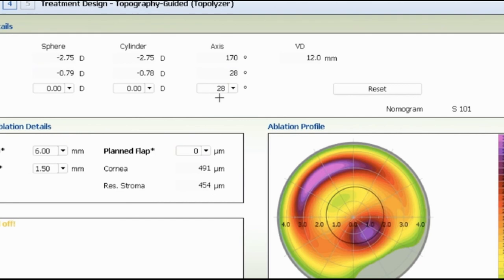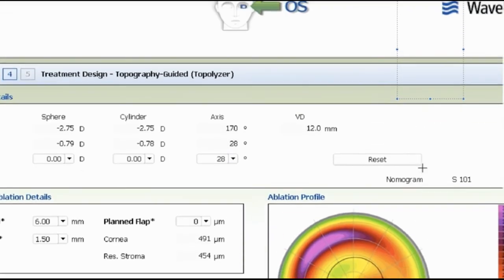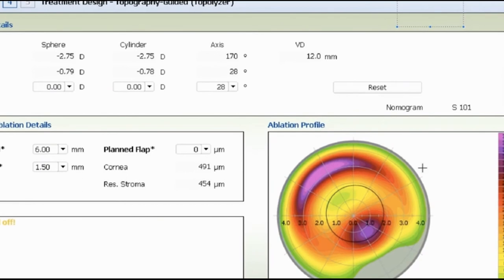And this will really make you think. Let's assume this patient has cornea thickness of 390, okay? How can I fix this cornea? How can I do laser on a 390 cornea? If I use this, it's going to remove from the cone 60 microns. So it's going to go to 330. What's a smart way to normalize the cornea and not take any tissue out of the cone?